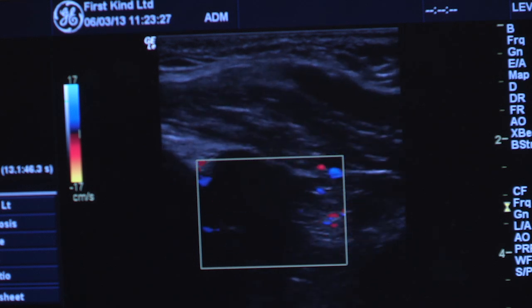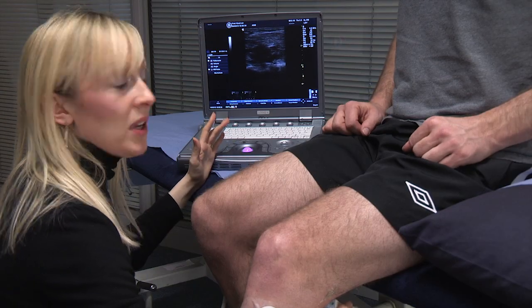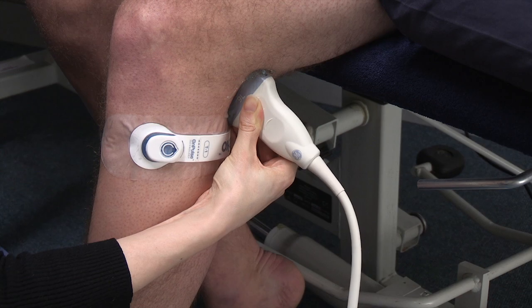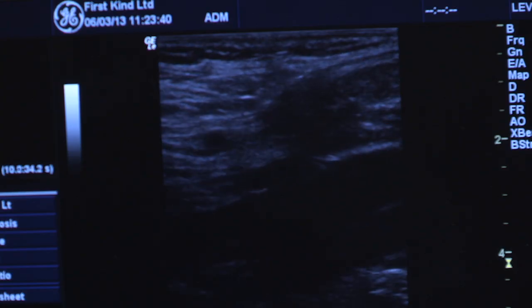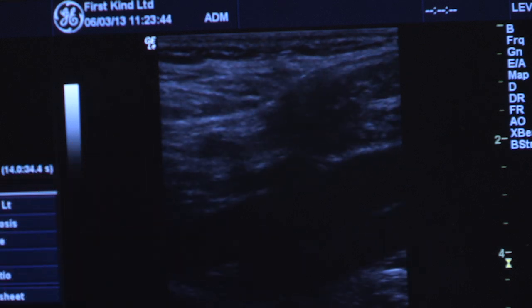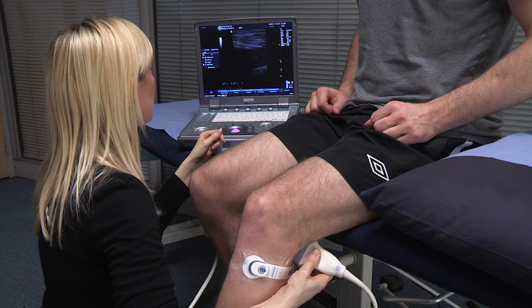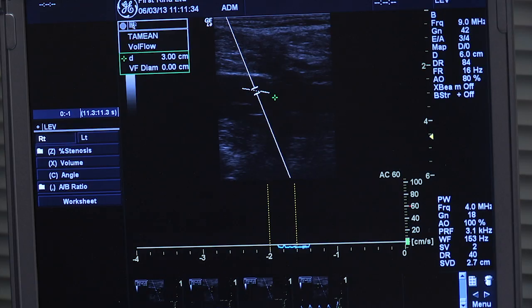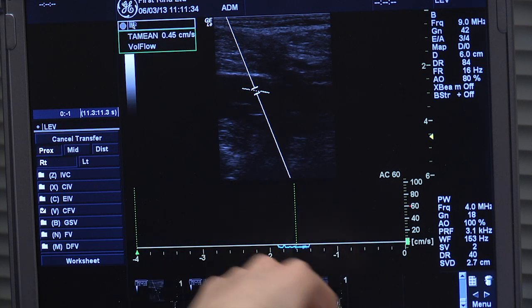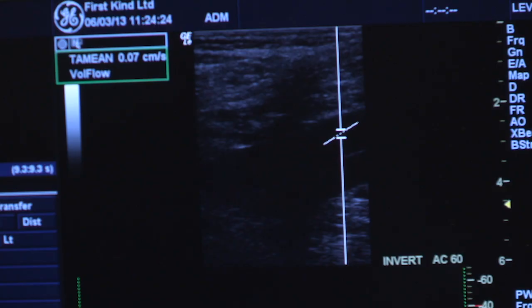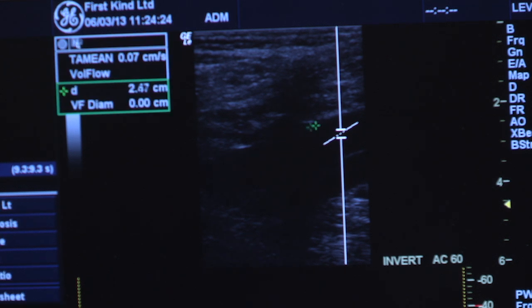The next step — I'm happy with where I am — is that I'm going to turn the probe into a longitudinal view. You can see again the vein is above and the artery is below. I'm going to interrogate that vein in a little bit more detail, look at the blood flow. I'll then move these calipers over a four second window and then measure the diameter of the vein.